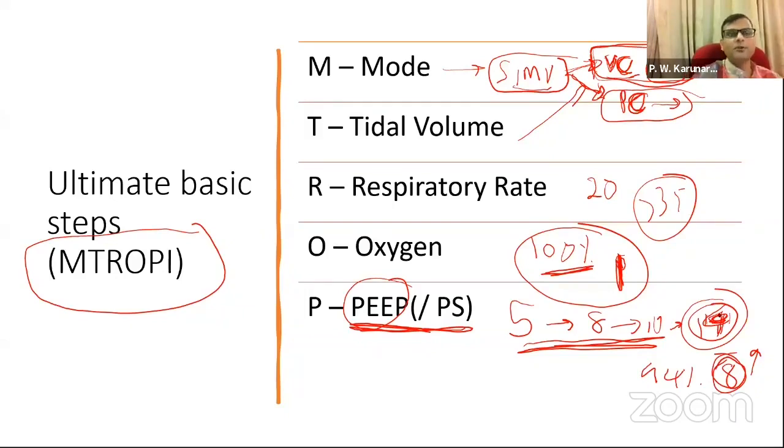If saturation is achieved, don't try to maximize it to 100% by giving very high PEEP. That is one piece of advice I want to give. And there is another thing called pressure support, which I don't think I will discuss right now. For the moment, focus on PEEP, and you can read about pressure support because I don't have enough time to go through these things.